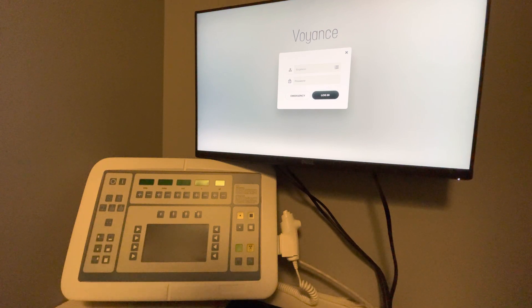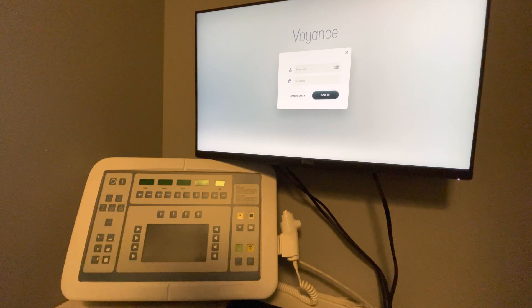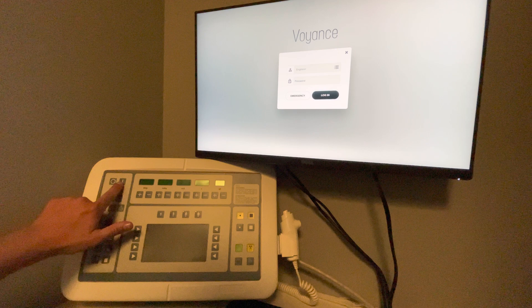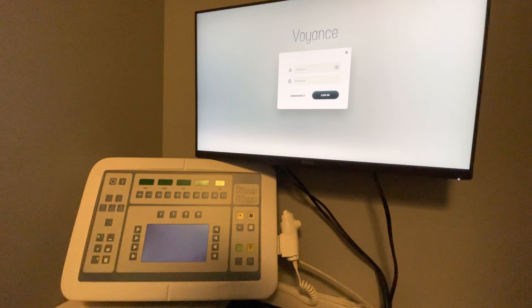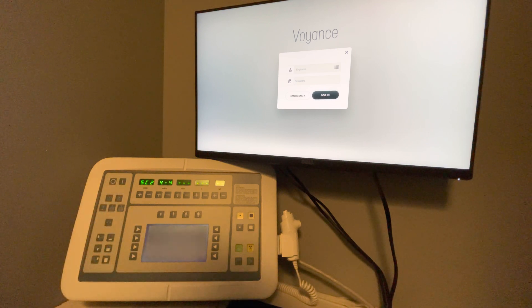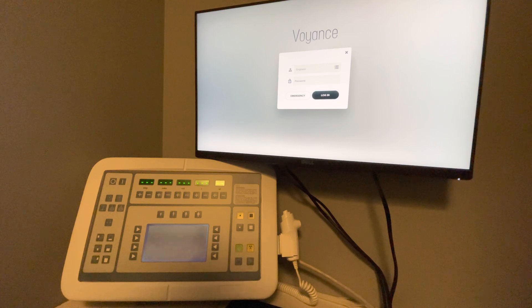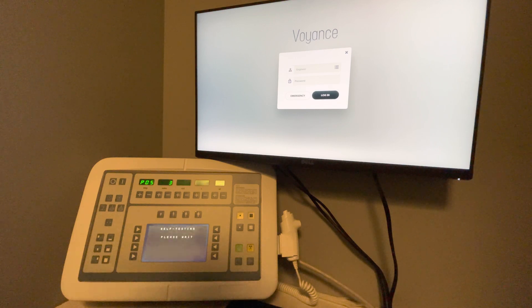Today we're going to walk you through how to take an x-ray with the Voyance software and the CETECAL TXR generator. To start, you hit the I button. This is going to turn the system on and it's going to go through a couple of self-tests. When the x-ray console comes up, that means the system is ready.